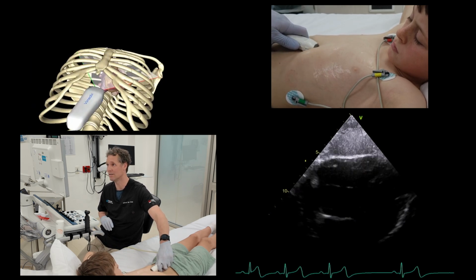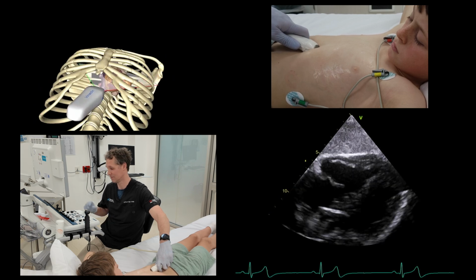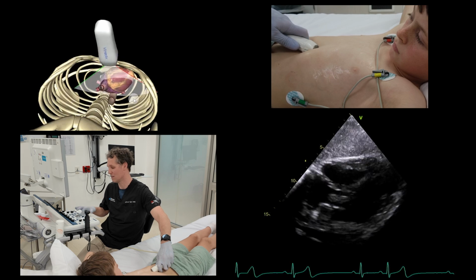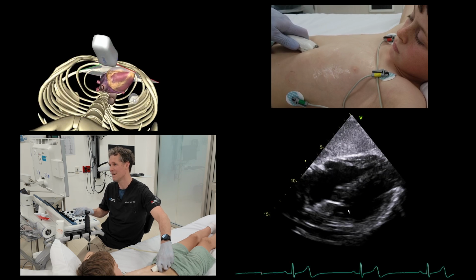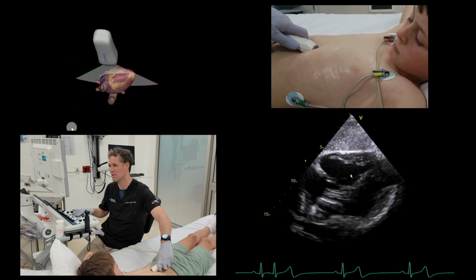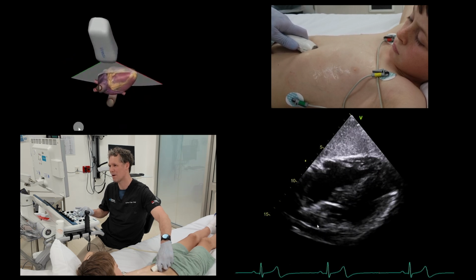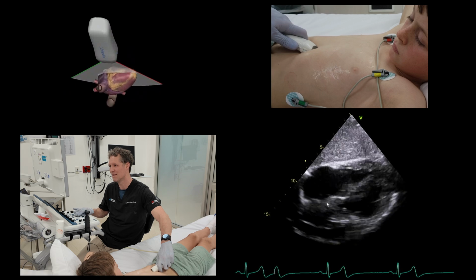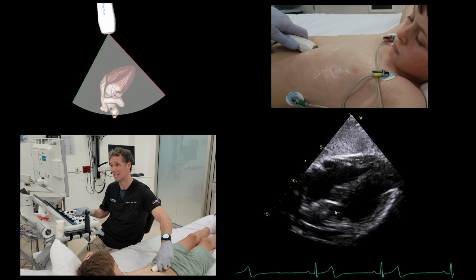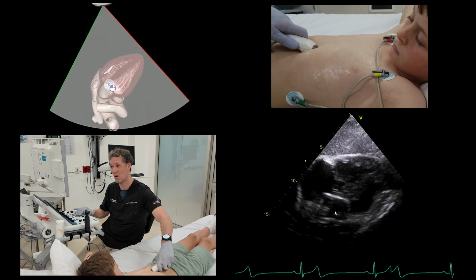And I look down into the heart. I'm going to have to increase up some of the depth so that we can see what we're looking at. And I can see this structure in the middle that looks a bit weird. Here's the right atrium, here's the right ventricle, left ventricle, but I can't really see the left atrium, and this kind of spherical structure in here that looks like it's a valve, and that's the aortic valve. If we remember, that sits at the front of the heart.